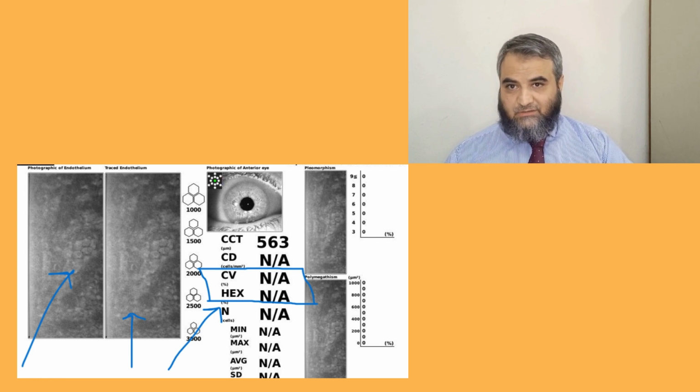If we don't consider this, the eye looks healthy, the cornea is still transparent, and if we take this patient to phacosurgery without the precautionary measures, without the use of cohesive and dispersive viscoelastics separately, and the phaco time and energy is enhanced, this eye, which apparently looks normal with no edema, will later on go into corneal decompensation and edema, maybe in 1 year, maybe in more than 1 year. So I wanted to share this to show the importance of specular microscopy.